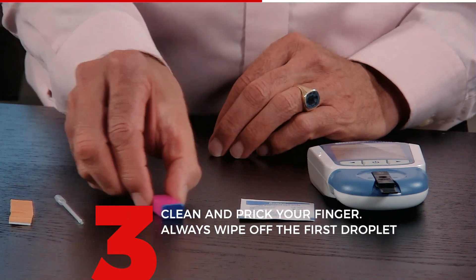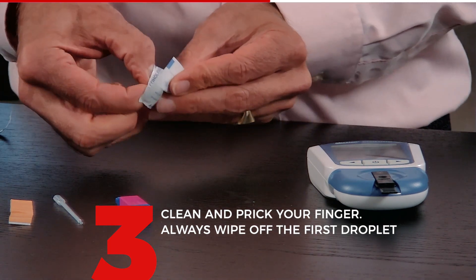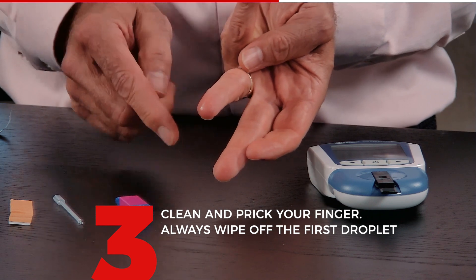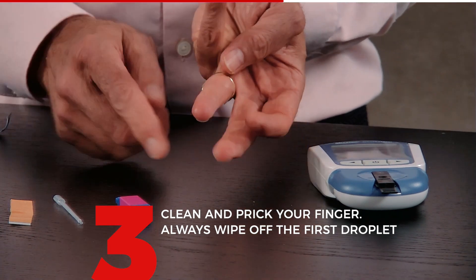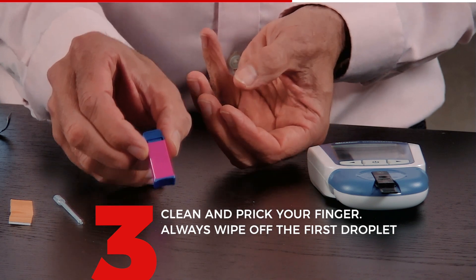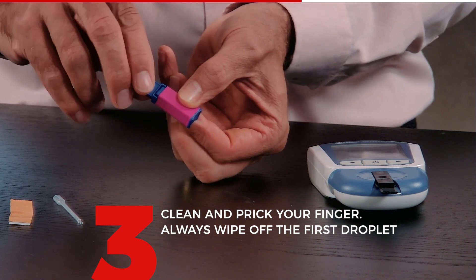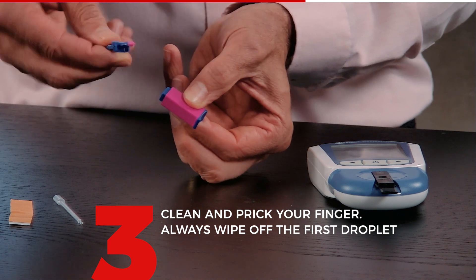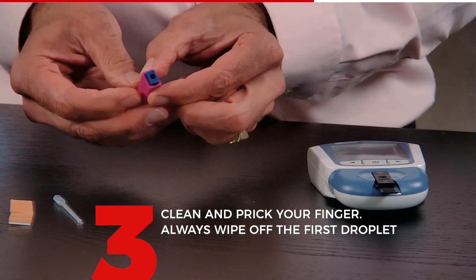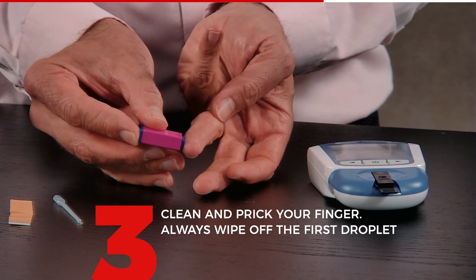I put the meter to the side and can now start getting ready to prick my finger. I take the alcohol wipe, open it, and clean my finger. Make sure that the finger is dry — blow a little bit until it is dry. I now have the safety lancet, which is a one-time use lancet. First, twist and take off the top cap. You will see the opening that goes against your finger. Hold it against your finger and press it until it clicks.